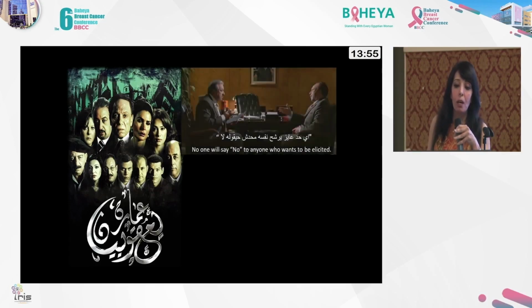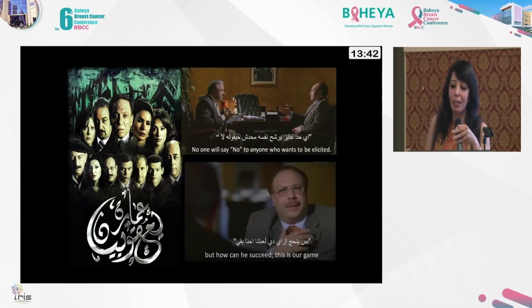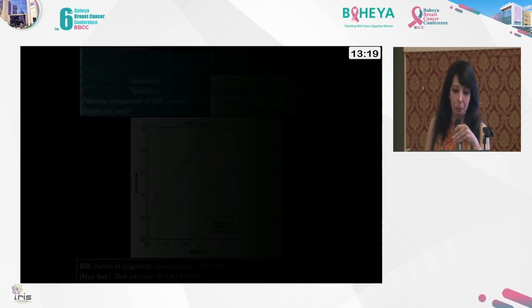Actually in the movie نور الشريف كان عايز يترشح للانتخابات، وكان عايز ياخد دايرة قصر النيل، وكان شاكك ان هو يكسبها. فساعتها خالد الصاوي كان رئيس الوزراء، فقال له اللي عايز يترشح يترشح، لكن اللي عايز ينجح دي بقى لعبتنا احنا. Which actually this goes with the calcification and AI. AI detects whatever he wants for the clustered and the grouped calcification, but when it gets to the diagnosis, it's our job. احنا اللي هنقول مين اللي benign ومين اللي malignant، لكن at least he will detect, will decide the distribution of the calcification, the follow-up, and for the biopsy.